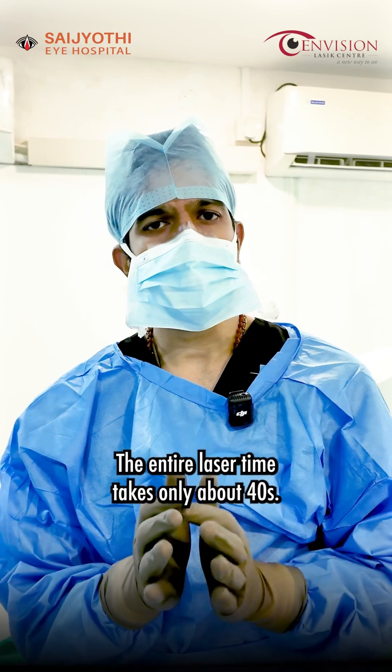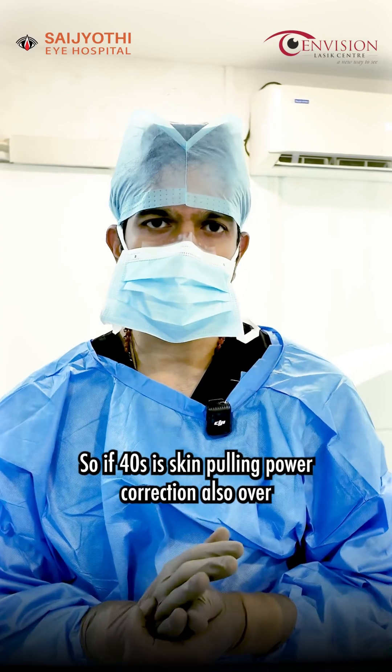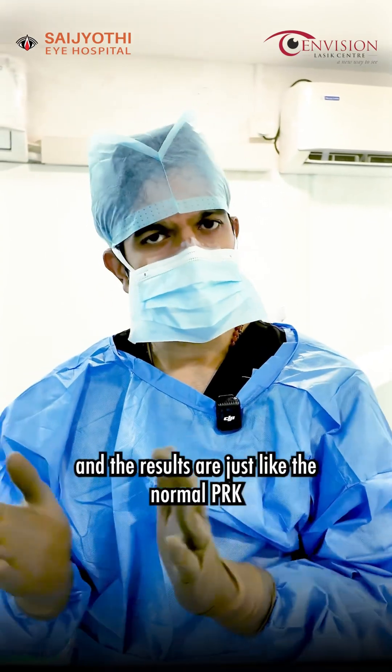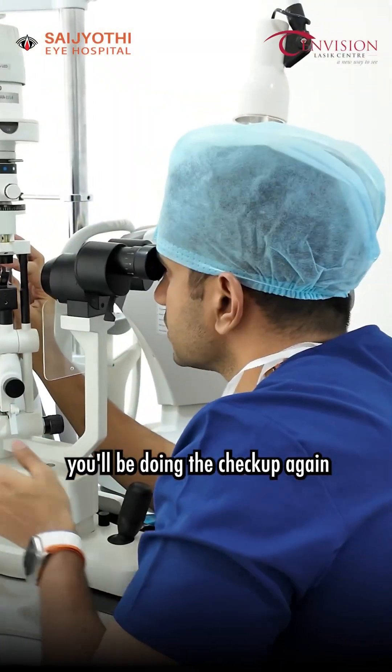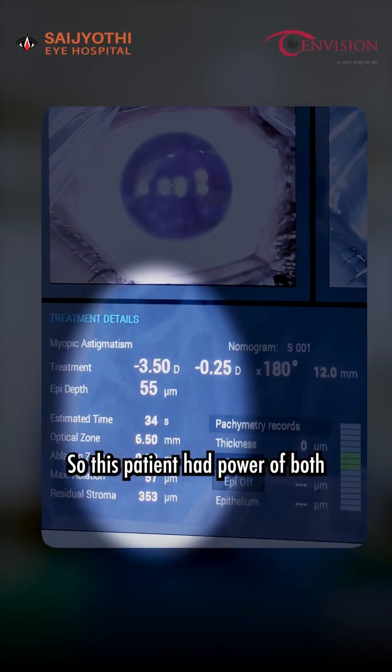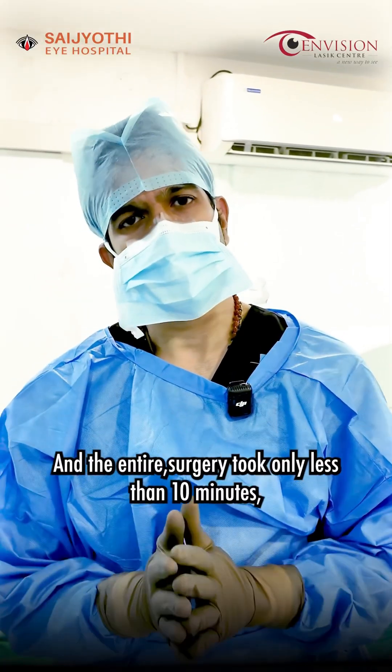The entire laser time takes only about 40 seconds. In this 40 seconds, we will get the power of the skin peeling, and the results are just like the normal PRK. One week later, we will be doing the checkup again. This patient had a power of minus 3 and minus 3.5 in both eyes, and the entire surgery took only less than 10 minutes.